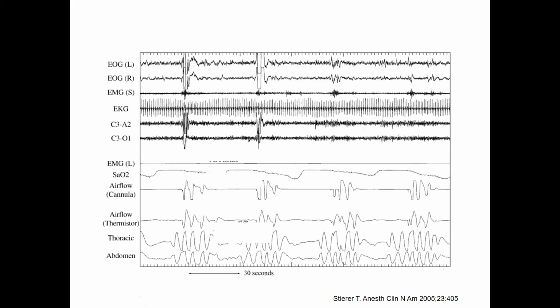By looking at both the airflow and thermistor, I'm seeing definitely a flattening of both. I see a desaturation that correlates with each flattening of the airflow events.